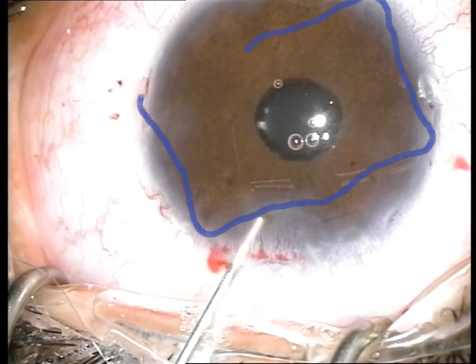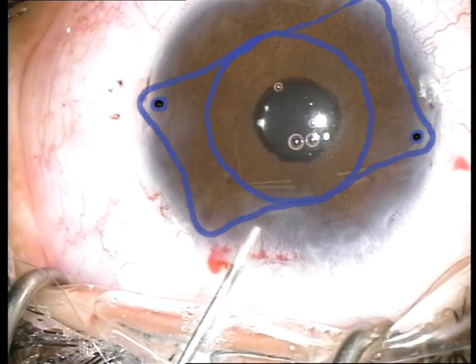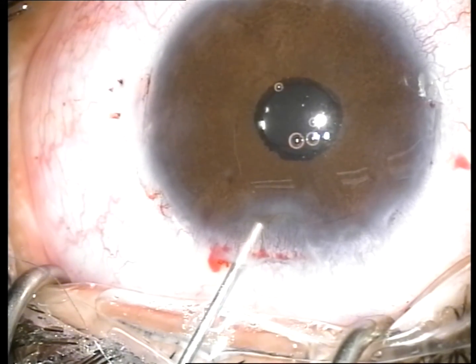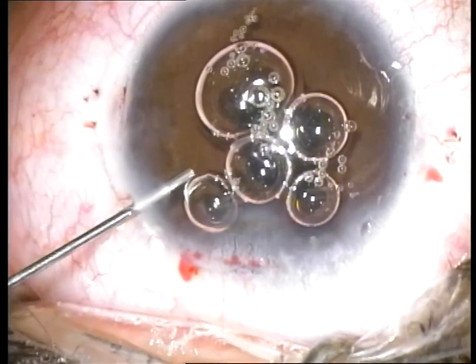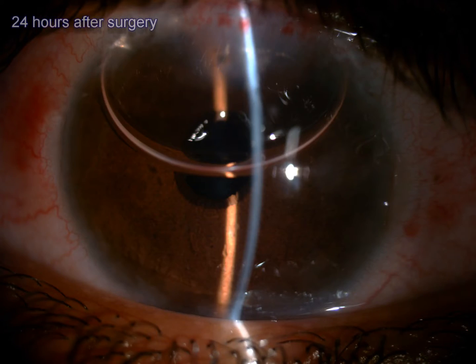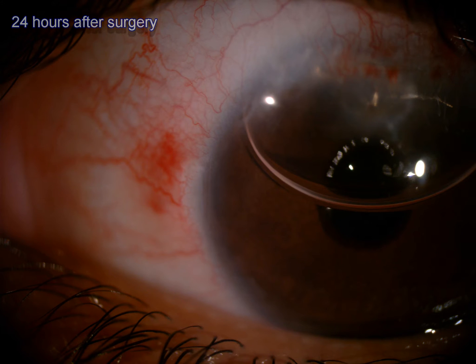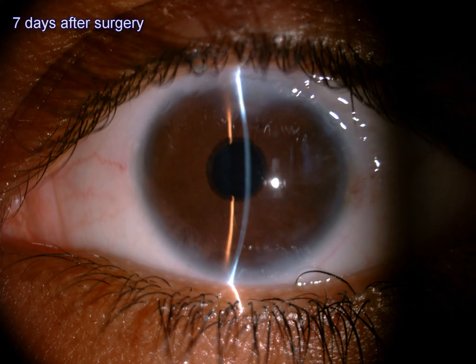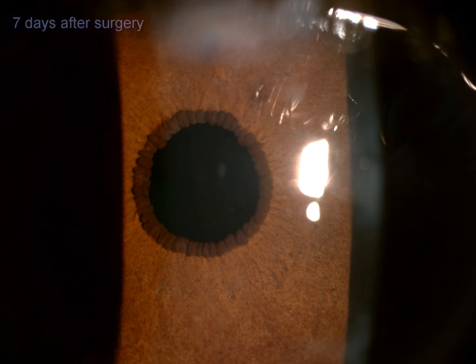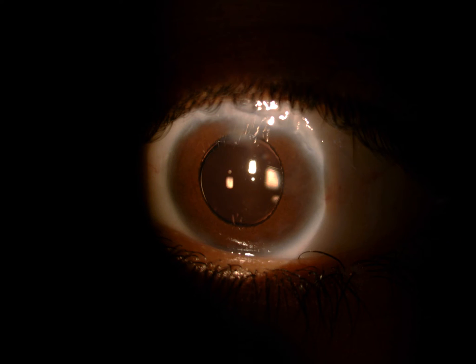The blue line shows a schematic arrangement of the lens under the iris. Six-month clinical results show a good visual profile and minimal induced astigmatism. All eyes achieved excellent centration and stability of the IOL.